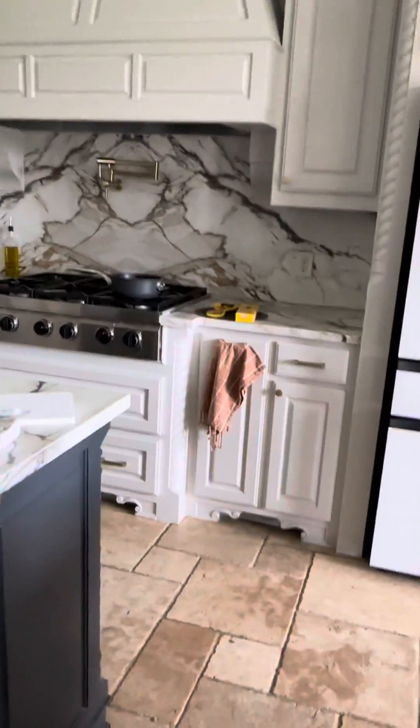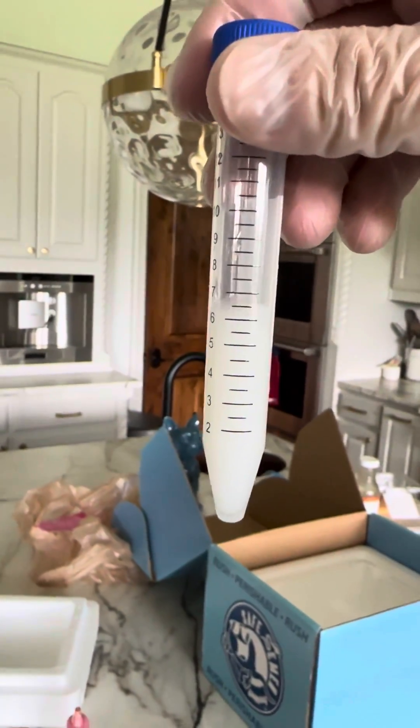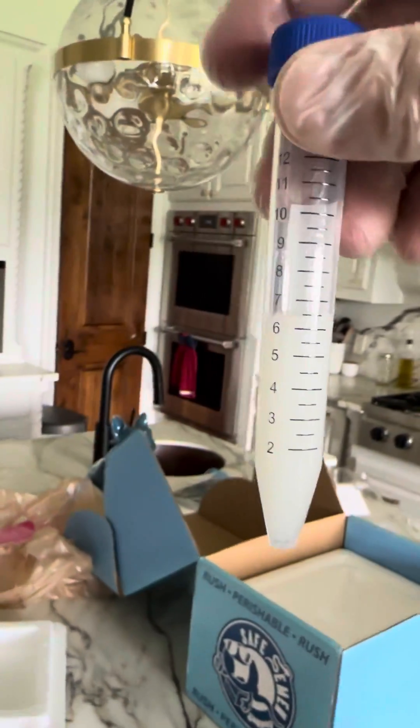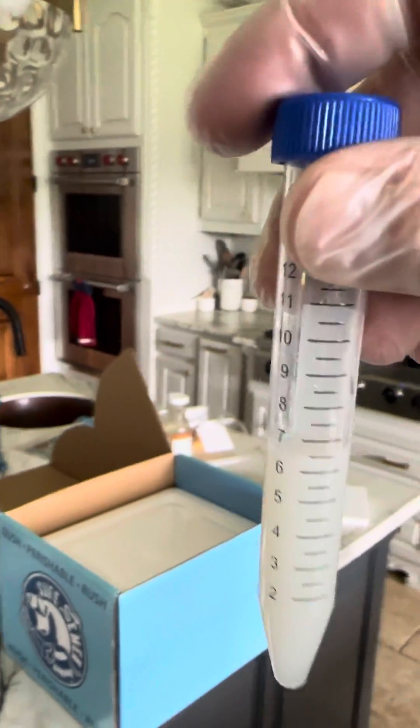This is getting shipped. Now I've mixed in the extender, one-to-one, and now we're at 6 cc's. I'll tape the top just so this cap doesn't come off accidentally.